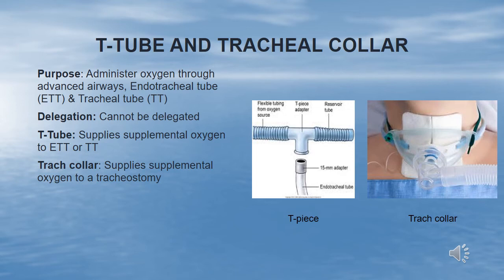Oxygen may be provided to these tubes in a variety of ways. If the patient needs to be ventilated, the tube is connected to a manual resuscitation bag, which will be discussed later in this PowerPoint, or an automatic ventilator, which will be discussed in future courses.